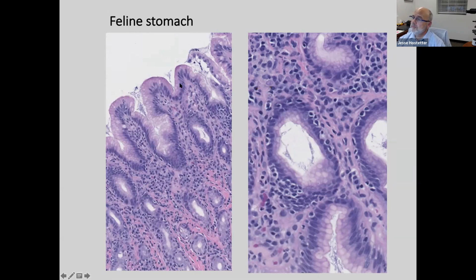Remember that you will see those in dogs and cats out here in the luminal surface or the superficial gastric pit, but when they start getting deep and down in the deeper parts of the gastric pit and down further into the gland, I think that's significant. And then for me, like you see here in this image, a pretty intense lymphoplasmacytic infiltrate around the glands. That also is a pretty good indication that you're dealing with, at least it incriminates Helicobacter in this case.